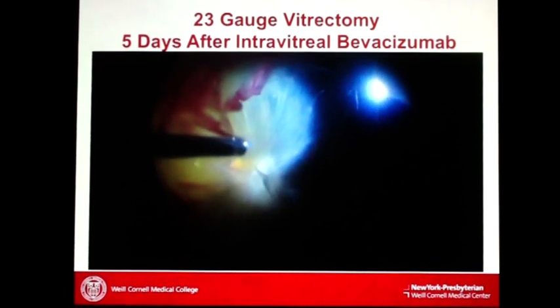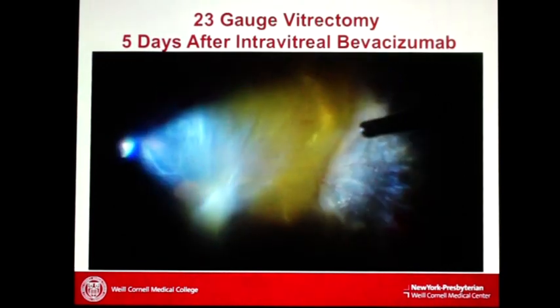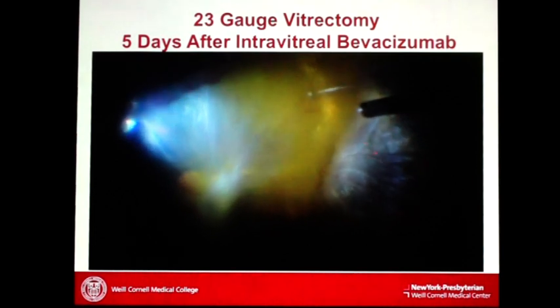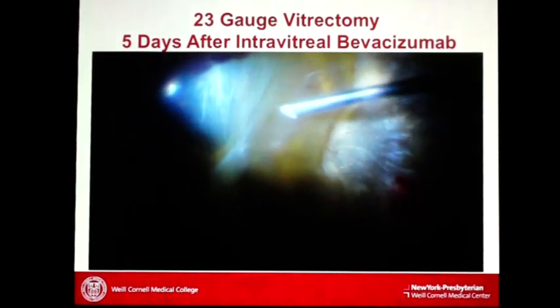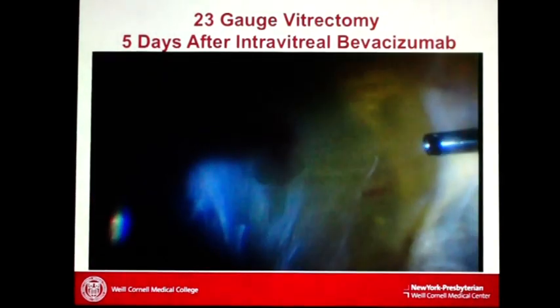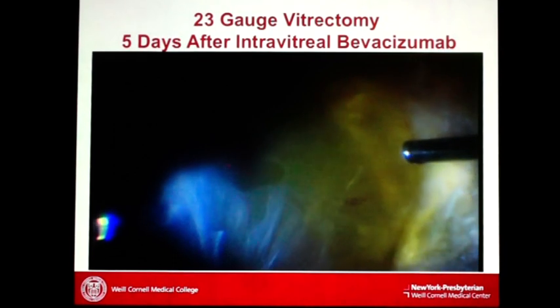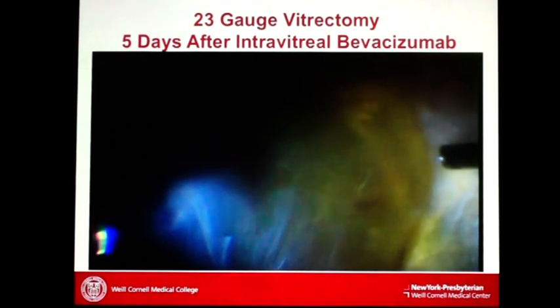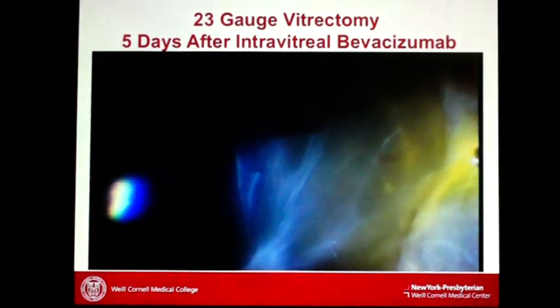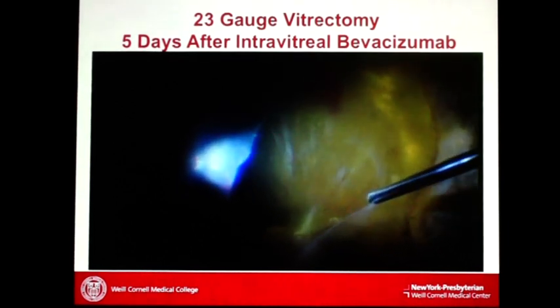In the left eye, we obviously had to operate, so we injected Avastin, and you can see here the avascular. It's no longer vascularly active, but you can see here the sheets of vitreous. It's like rubber. And here's the peripheral retina. What you're trying to do is dissect all this vitreous and the traction from the retina. Here's the scleral depression. Okay, a lot of subretinal fluid coming out here. And I was happy that that was not retina that I'm cutting.